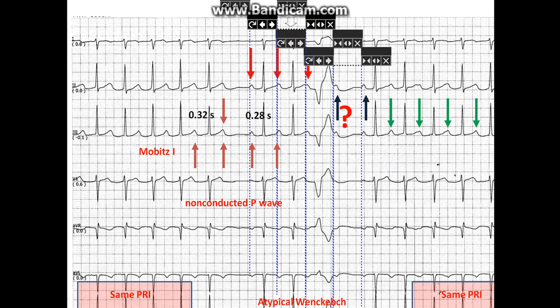There is one more thing this strip can teach us. As mentioned, most textbooks will tell you Mobitz 1 is a progressive prolongation of the PR interval until you encounter a non-conducted P wave. However, in this case, the PR intervals at the beginning and latter part of the strip are the same — but prolonged.